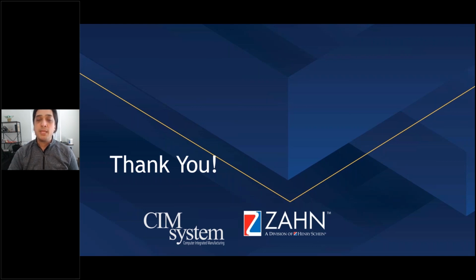using your permanent license. And in the meantime, let's say that you've decided, I want to go ahead and get this upgrade, and I want to start using this newest version. You can definitely arrange for that with your Zahn rep and their technical support team. They can get you the latest version and generate a temporary license for you for 30 days or whatever the period is that it's going to take to fulfill your order, and then they can get you up and running as soon as they can connect with you to get that done. So you don't actually have to wait for the upgrade to process to be able to take advantage of these features.